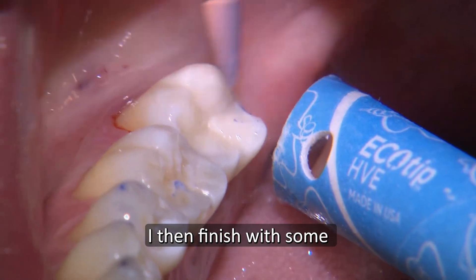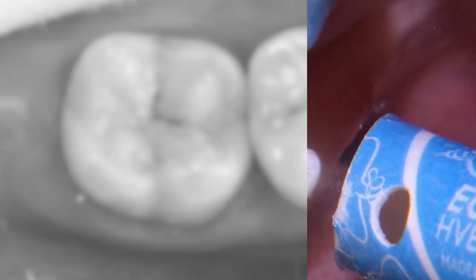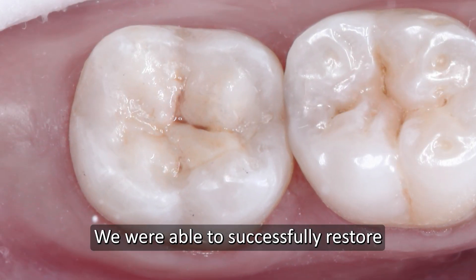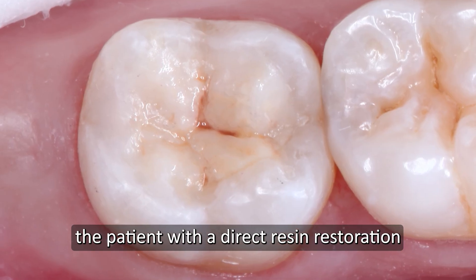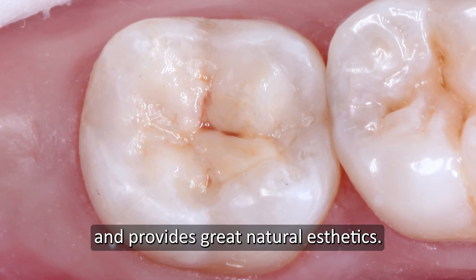I then finish with some rubber tip composite polishers to achieve a smooth surface. We were able to successfully restore the patient with a direct resin restoration that's both strong and provides great natural aesthetics.